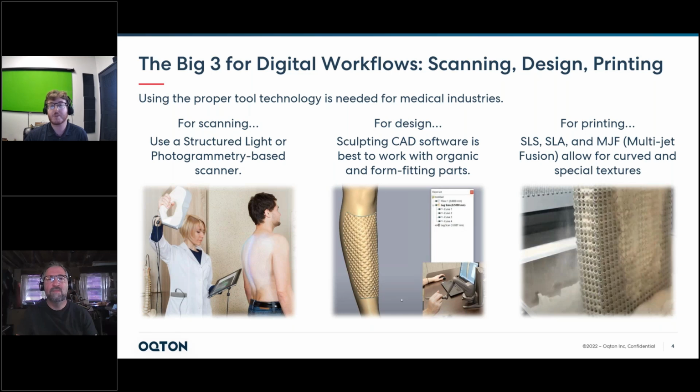And it's very popular for the medical world because it is very adaptive to freeform shapes and the movements of people. If you ever look at a laser scanner, it's very highly accurate, but people can't stand still, which is why it's very popular for sheet metal or mechanical shapes. So the structured light scanners specialize in this ability to capture the curvatures of people and remove that outlier data, so that way it's a lot easier to work with that data in particular.